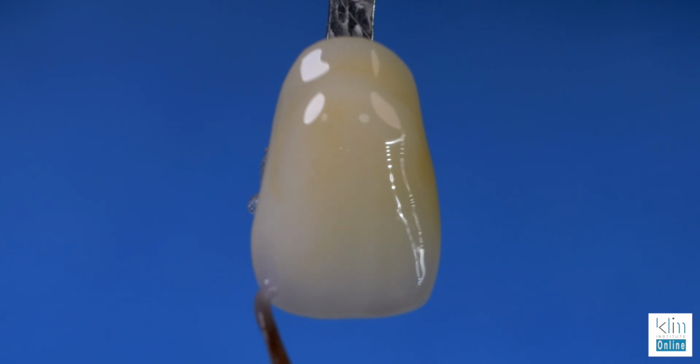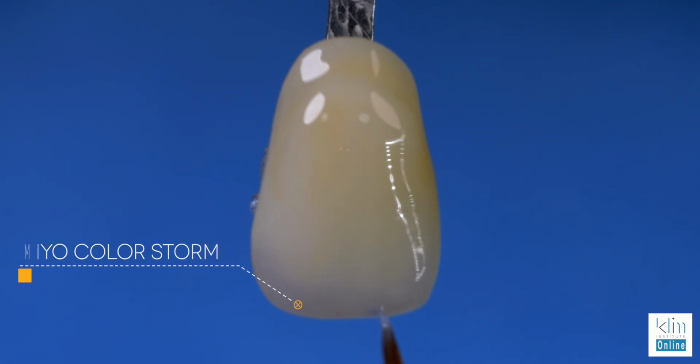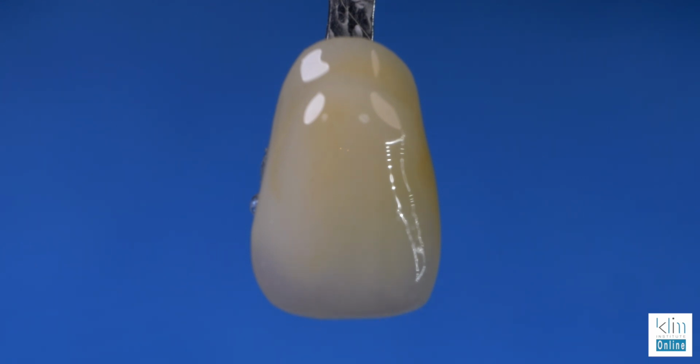You place the saturation, then you move the saturation around until you get what you want. Just that in itself looks great, bringing down the value, creating an incisal translucency. And then to accent that, that's where Storm comes in really handy. We're going to accent the incisal component of the primary depression. Centrals have two, where it pops that translucency effect just a little bit more. And then we can work that around the line angles as well.